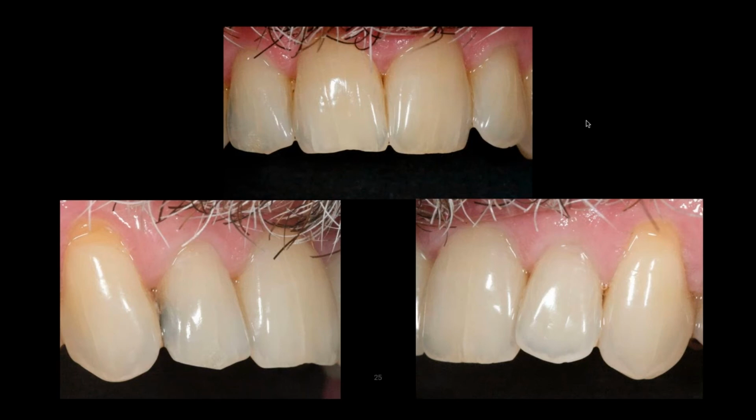Even if you use glass ceramic crowns, that's a low fuse, and you have to be careful. You bake them too many times, you can make them a little too translucent. And I haven't found that to be a problem with VITA blocks at all.